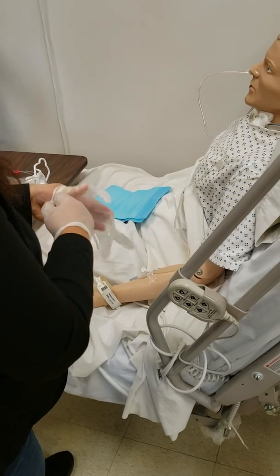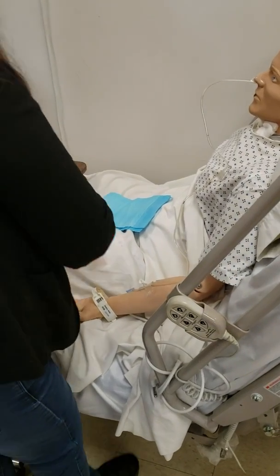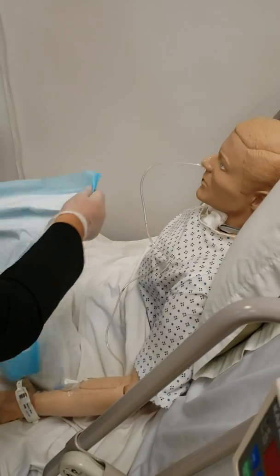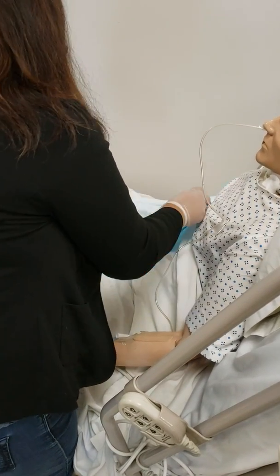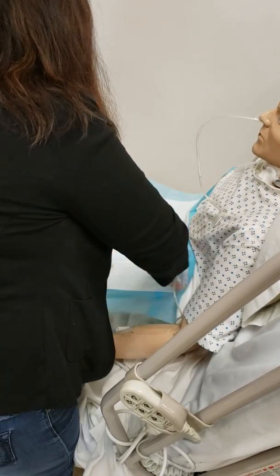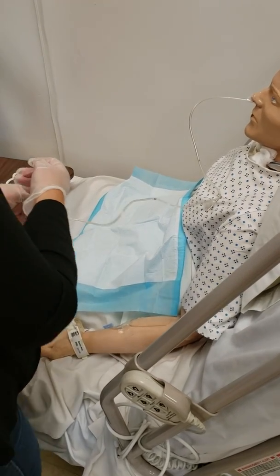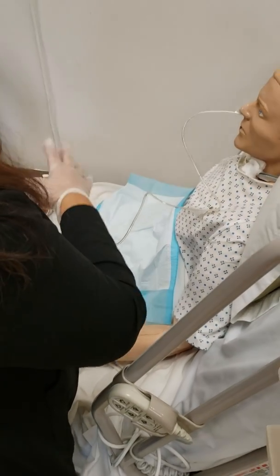Over here, and here, to prevent any splashes. All right, so there's a cup here, usually, because you're not supposed to allow this to be open all the time.